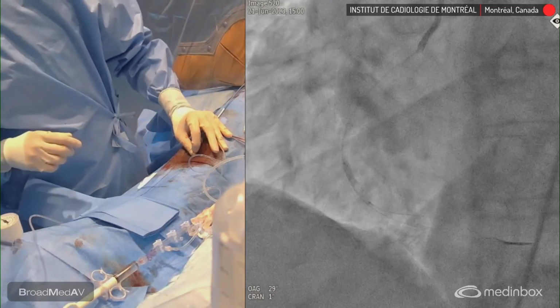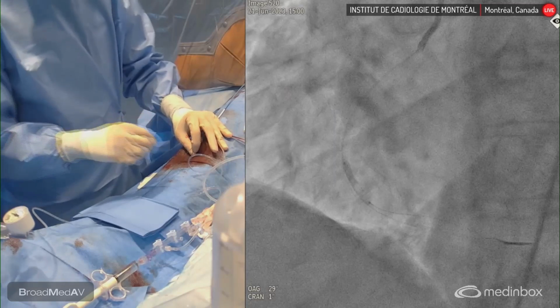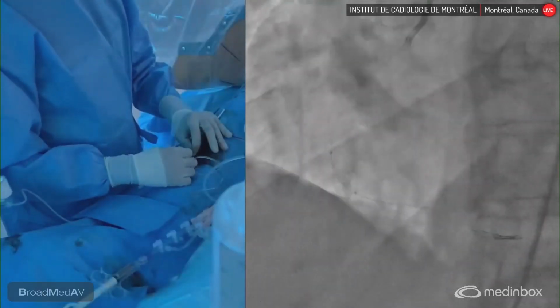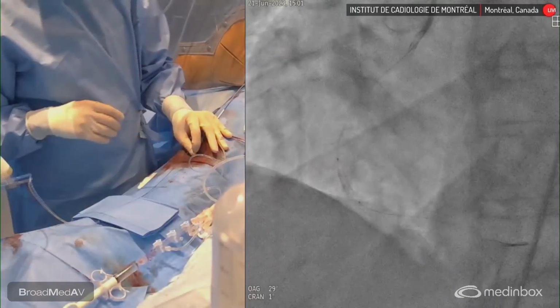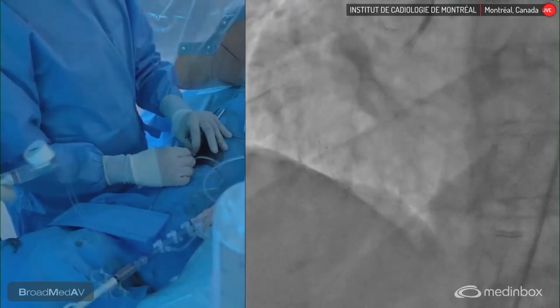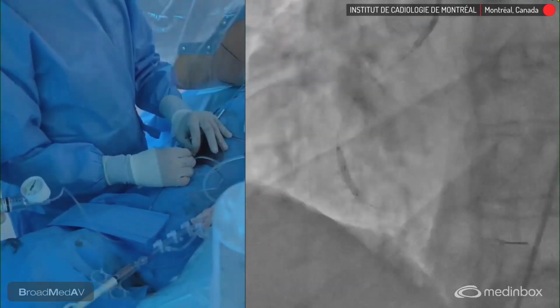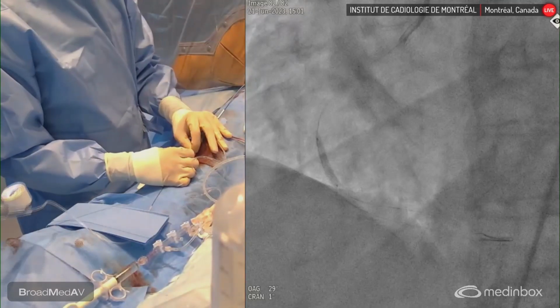And there's another question that says, what are the complications and their solutions if a microcatheter tip breaks within the lumen? I've had this a few times. Let's expand the stent. So it depends where it breaks, if you're intraluminal versus subintimal.